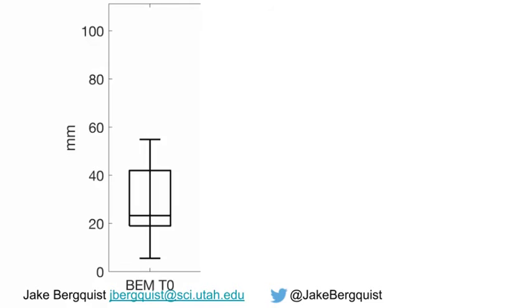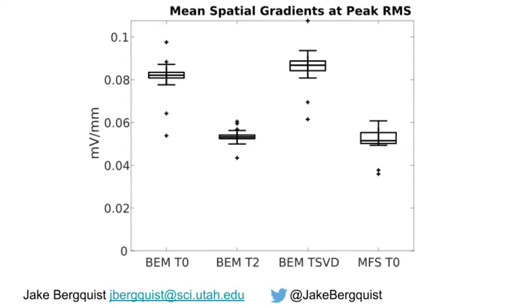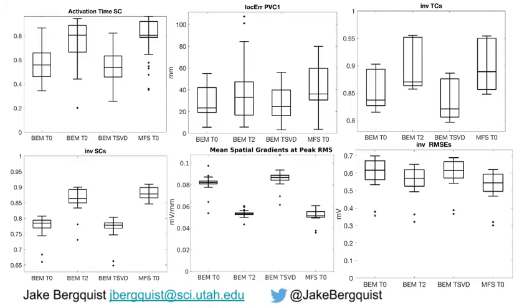The next metric we examined was localization error of the earliest site of activation. Finally, we calculated the average spatial gradient of potentials at the peak of the RMS for each of the reconstructed beats. Overall, our experimental platform, and in particular our rigid pericardiac cage, has allowed us to generate a dataset in which many of the familiar sources of error are attenuated.